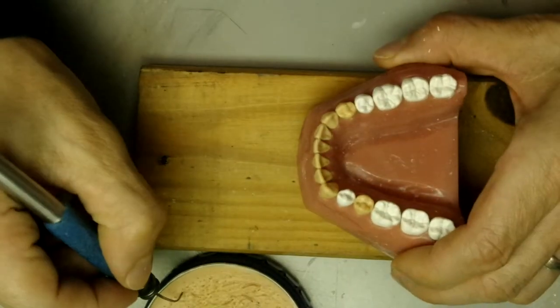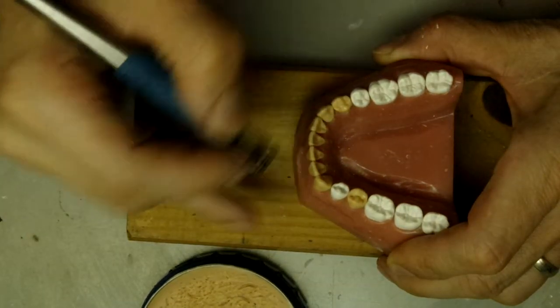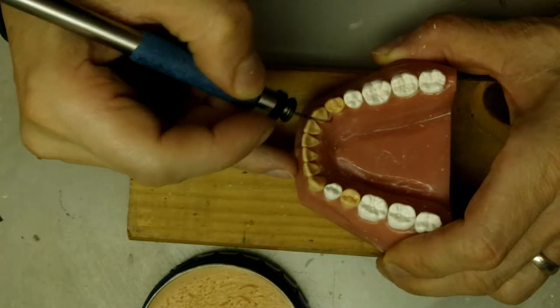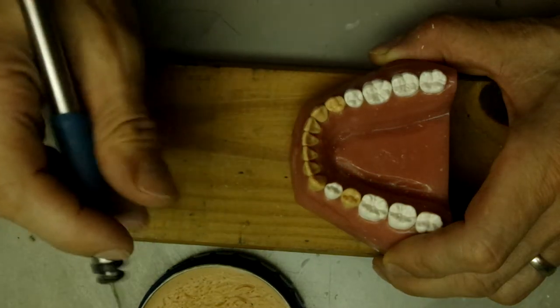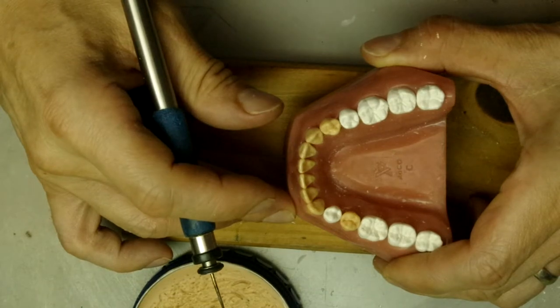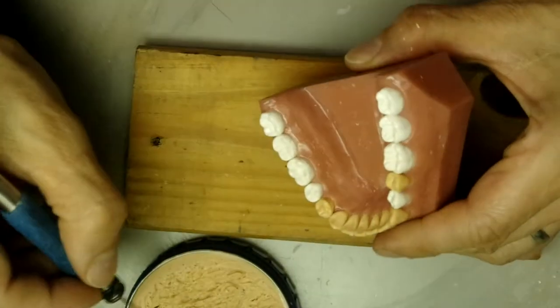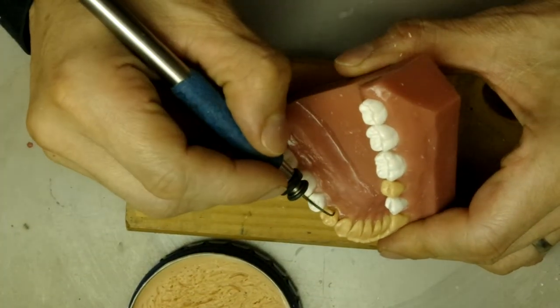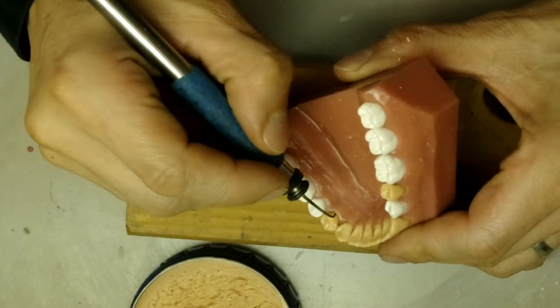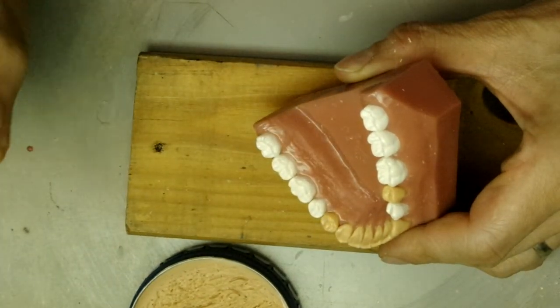We'll do the same thing here. The first premolar also looked a little flat, so I'm going to go ahead and increase the width a little. Much, much better. Sometimes you don't see things the first time, and then you walk away and come back to it — and you end up seeing something else. Sometimes it helps to put things down and come back to it later.